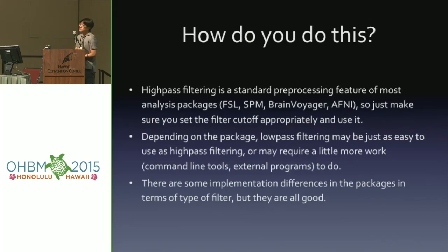Okay, so how do you do this? For a high-pass filter, because it's well known and suggested by everybody in the field, all the existing packages have very easy implementations of it. Normally, you can just click a button. For a low-pass filter, for some packages, you probably have to run a command line.